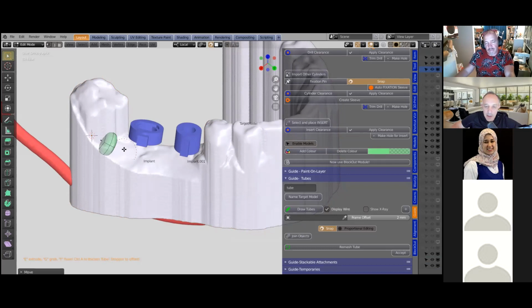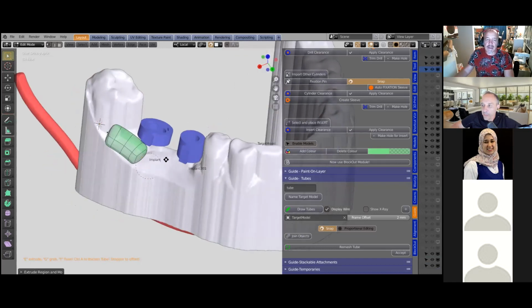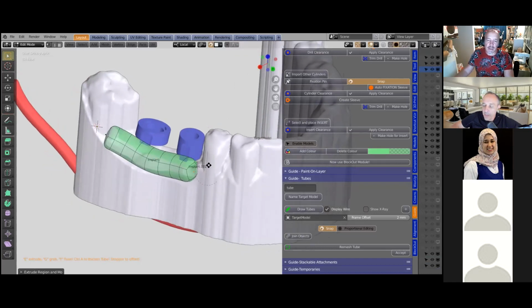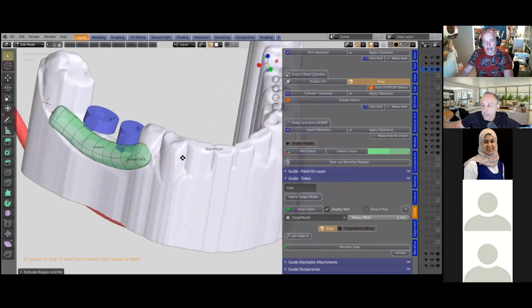Well, it depends. I mean, Michael, I think you can cover quite a bit of area to make sure the tube will actually fit well against the teeth. So it still has a bit of retention. Hey, Michael? The ones that we've printed have a lot of retention. Sorry, yeah, keep going.